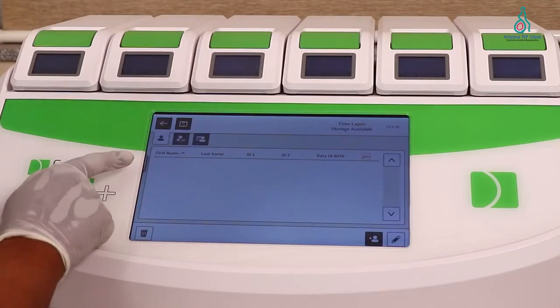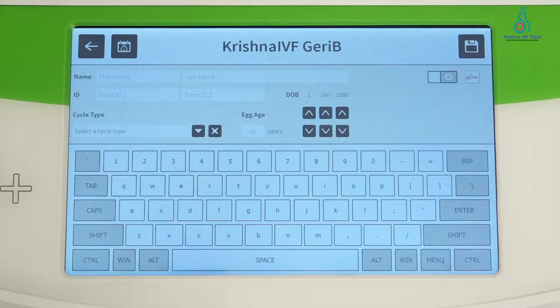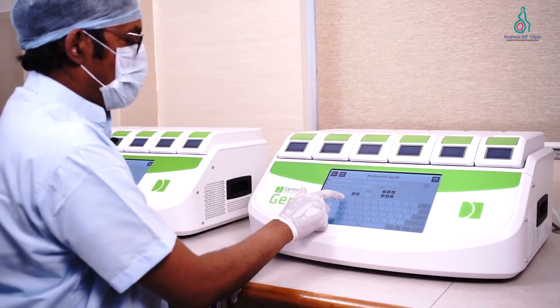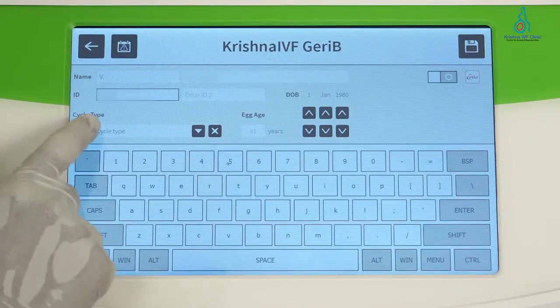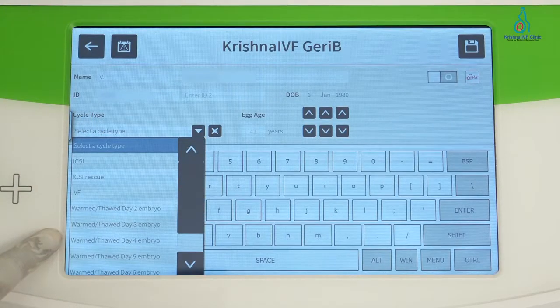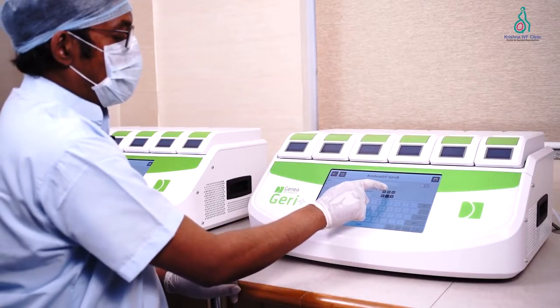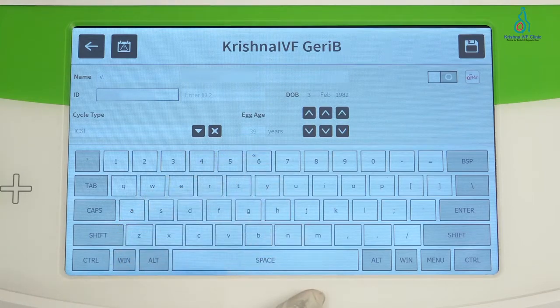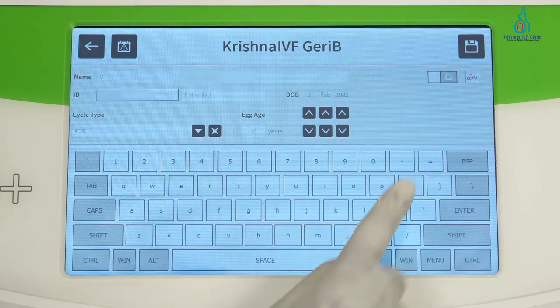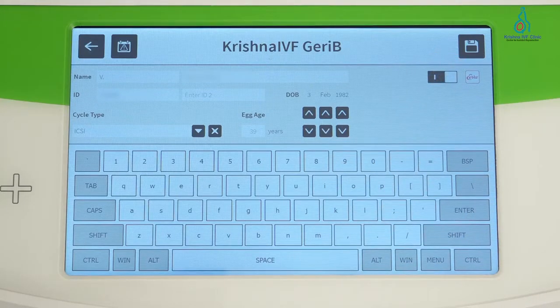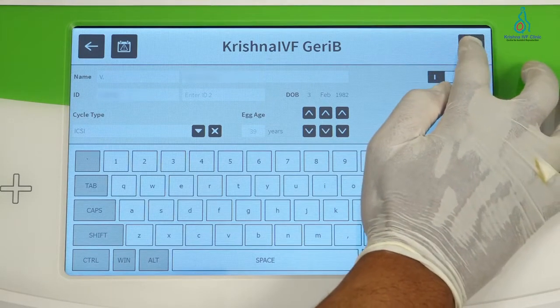For adding a patient, select 'Add Patients' and start with the name and patient ID. Then select the cycle type and egg age — we can adjust the egg age with these keys. If you want to use EVA software, click here and then save.